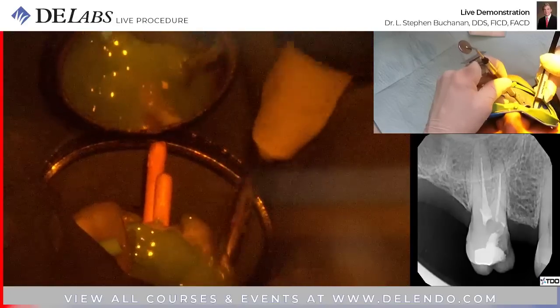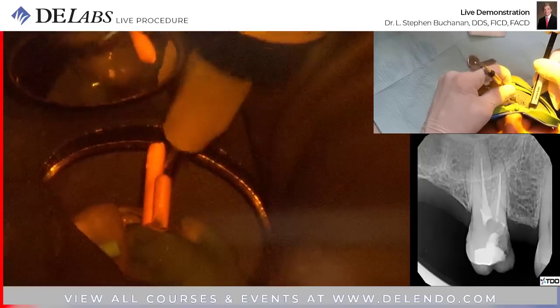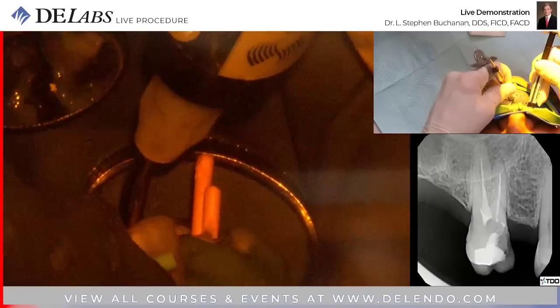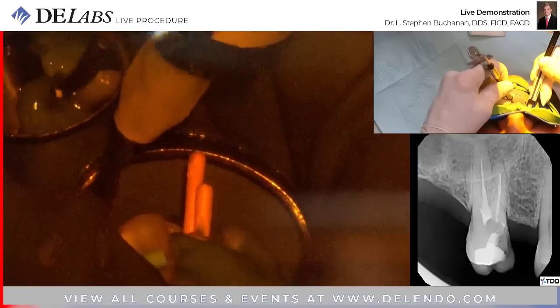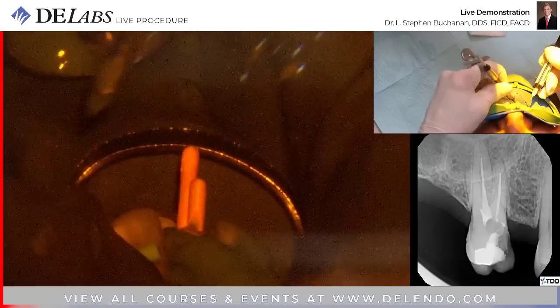The more support I can get laterally, you can see I went forward to be on the adjacent tooth, the mesial adjacent tooth. Here I want to use the rubber dam clamp to support this.